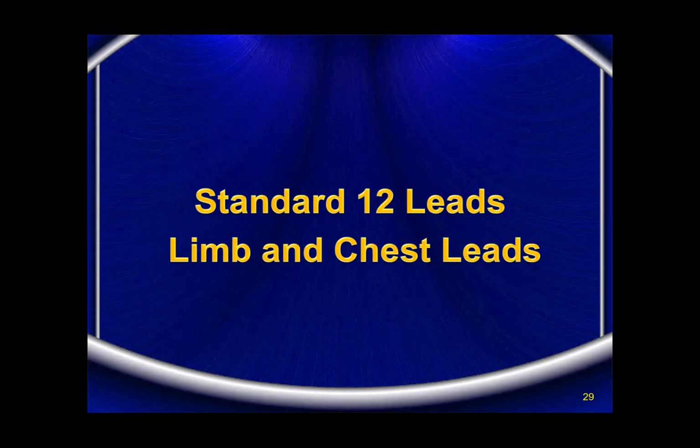Today's exercise is to get familiarized with the ECG paper, to get familiarized with the various waveforms and intervals, and also understand the electrophysiology behind that a bit, and also the duration of each of these waves and the amplitudes. Having done that, we understood what is ECG and what are the precautions in recording the ECG. Now we go to connect the patient to the standard 12 lead ECG. We call it a 12 lead ECG. Why 12 leads? Why not only one lead?